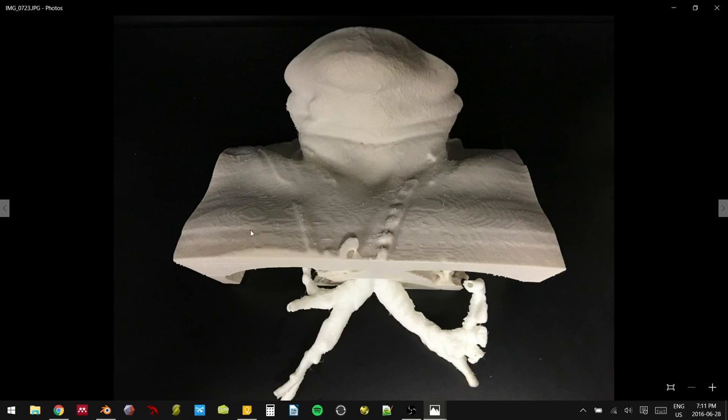So this is just the same stuff that I kind of showed off in the first part of the series, way back before we even did the segmentation. This isn't the airway that we just printed, but this is the holder. The holder is printed again from patient CT according to this chin and chest model. It's just meant to hold the airway and make the simulation slightly more realistic and give it the right angle for the airway as well. There's just a cutout for the airway that resides within this model, and you can actually swap the airways in and out.